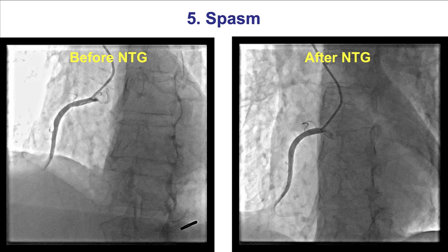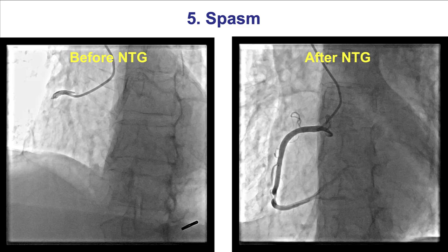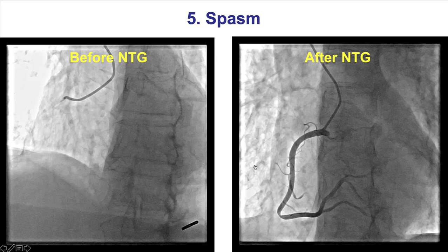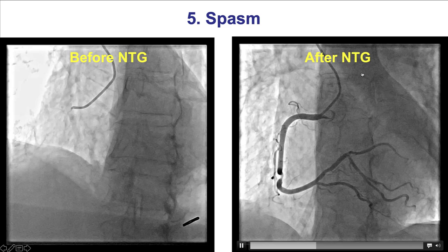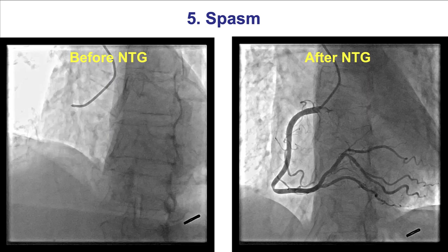Spasm is another cause of acute vessel closure. This is a patient with severe lesions in the distal RCA and posterolateral vessel. All these lesions disappeared after intracoronary nitroglycerin. That emphasizes the point that nitroglycerin should be given in all patients before coronary angiography unless there is a contraindication such as hypotension.